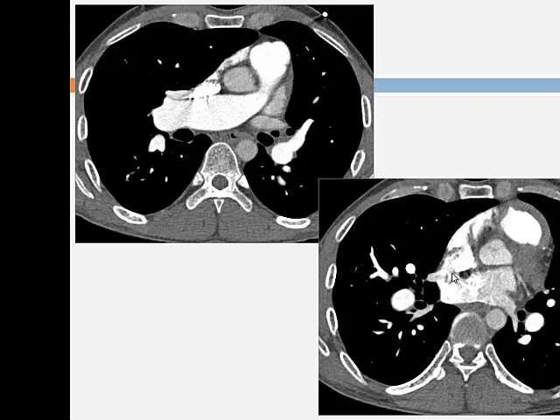Okay? But in general, if you're reporting a CT, you see a dilated right heart, lungs, PA, no PE, okay, am I missing an ASD? Am I missing anomalous venous drainage? Okay, so just have that system in your head.